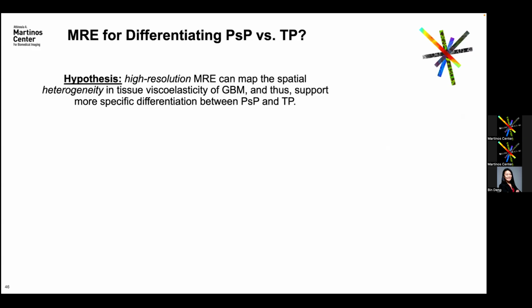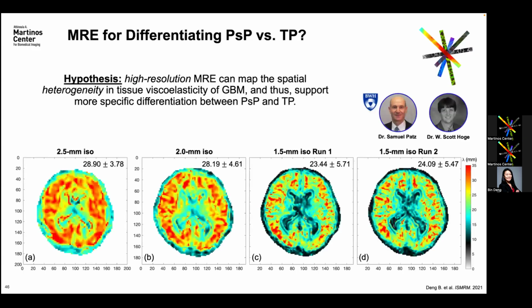I want to emphasize that the high resolution is very important here, because we tried several different spatial resolutions, and at higher resolution you can really appreciate and differentiate between different parts of the brain, such as the white matter tracts. However, other groups have typically been using resolutions of 2 or even 3 millimeters for brain tumor imaging, which can be limiting for this particular task.